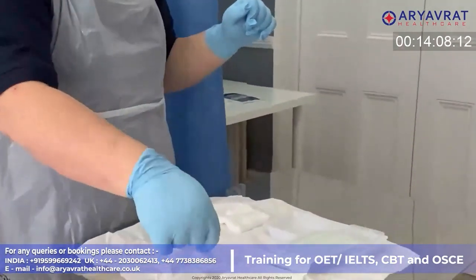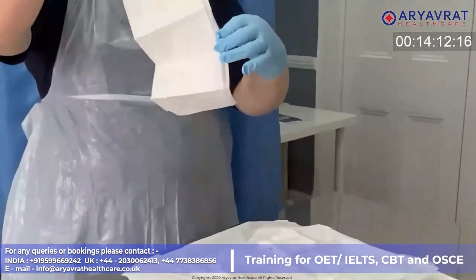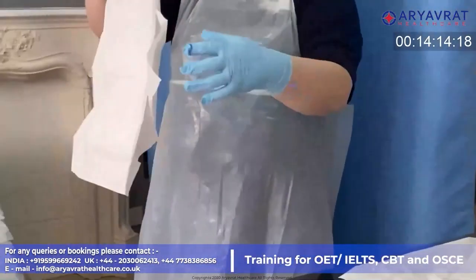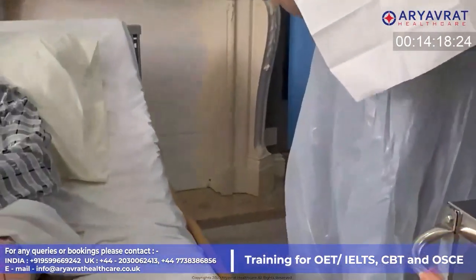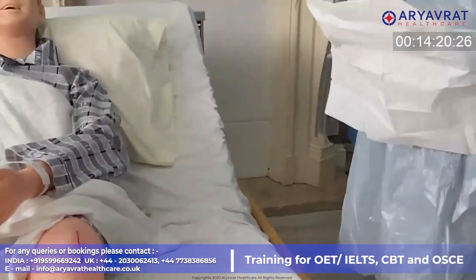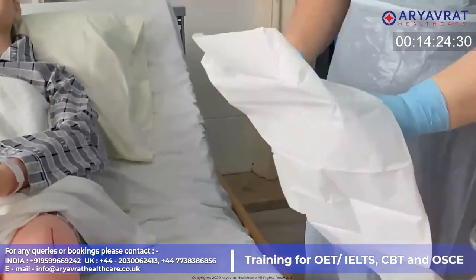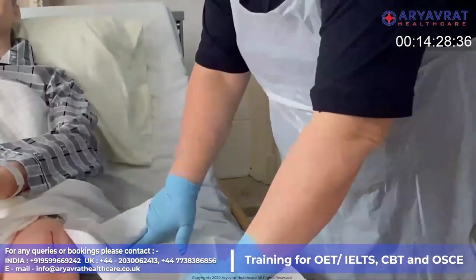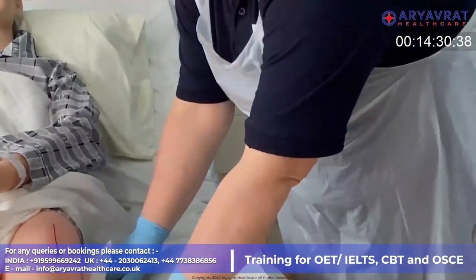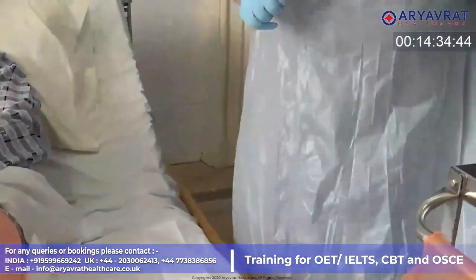I am going to place a drape adjacent to my patient. I'm going to make sure I do this by not contaminating my gloves in any way. Normally I would ask the patient to lift if they're able to, or have some assistance to do that, but at this point I'm just placing this here without contaminating my gloves.